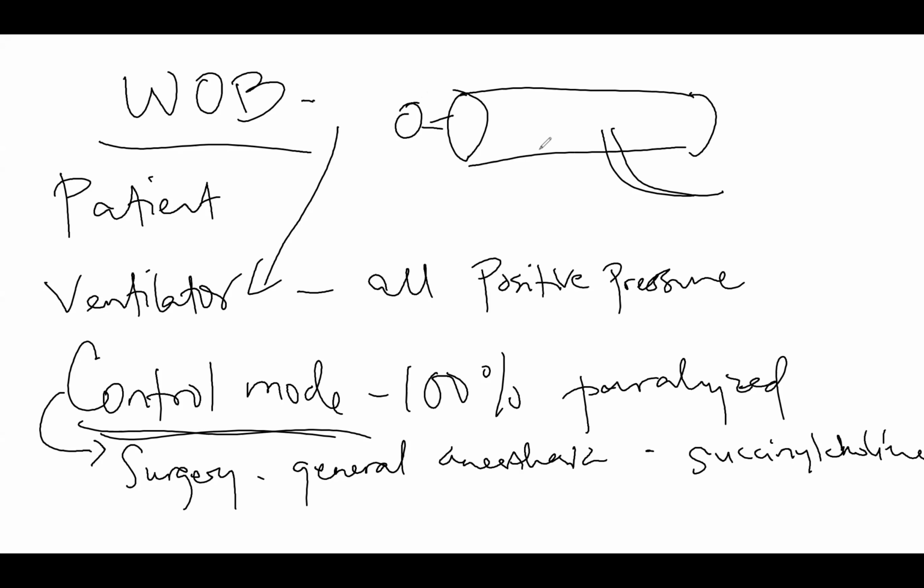Now imagine if our modern ventilators worked like this. How are you going to assess the patient? How are you going to clean the stool? How are you going to turn the patient? How are you going to change them? So negative pressure ventilators obviously did not work very well.